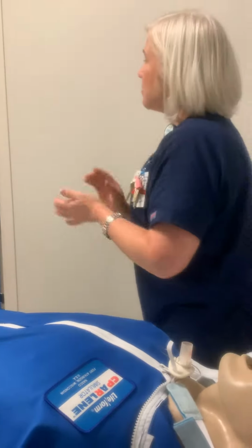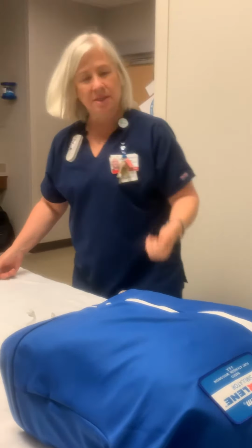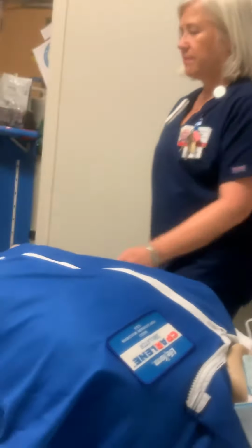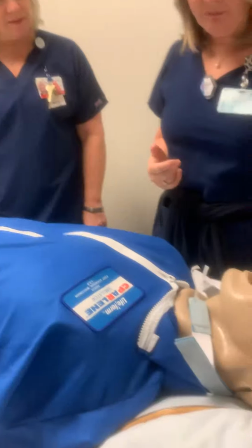Okay, so any questions between partial laryngectomies and trachs? Okay, so I have a patient with a laryngectomy. I need you to come up, this trach has fallen out. I have a laryngectomy and my trach's out. What are you going to do? You're the nurse. Assess their respiratory status, ask them. Well, they probably can't talk, but we're going to ventilate down here with a pediatric mask.